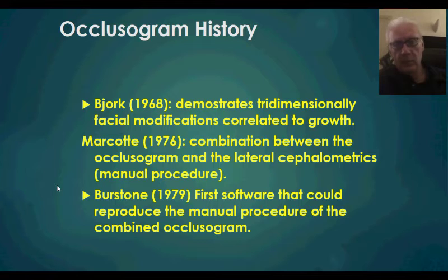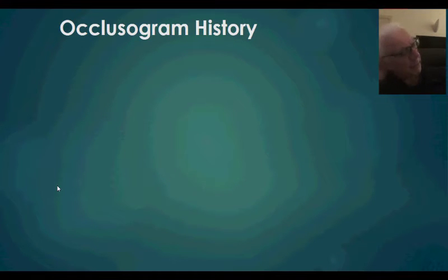And I can tell you, since I've done it for many years, that the manual procedure is rather time consuming and takes a lot of effort. And so for this reason, I think that at that time the occlusogram procedure was very much limited to few people who wanted to work with this tool.